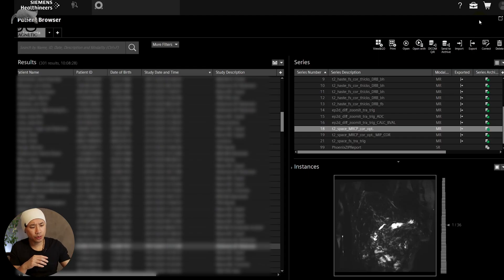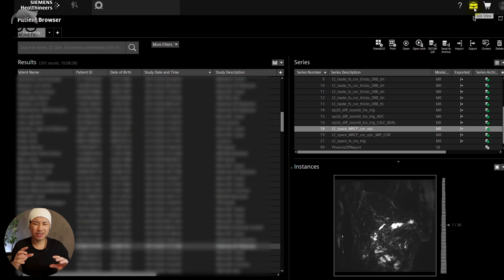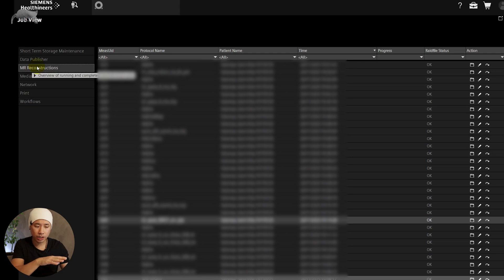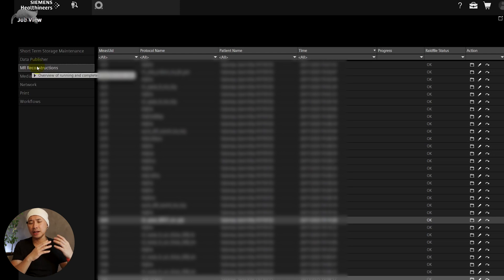Go here — this is where you can see all your patients and everything you've scanned. Within that patient, locate the specific sequence you want to do the retrospective on. Remember the name — this one is T2 SPACE MRCP. Click on it once and go to the Job View — it looks like a briefcase. Push that briefcase icon and you'll come in here. You have the opportunity to check the network if something isn't going over to PACS, or you can go to MR Reconstructions. The raw data will be there for a very long time depending on how many patients you are scanning — you can go two, three, even four days back and still do the retrospective.